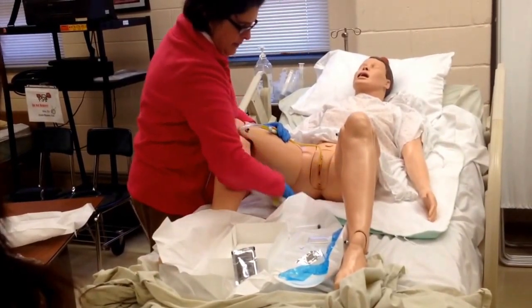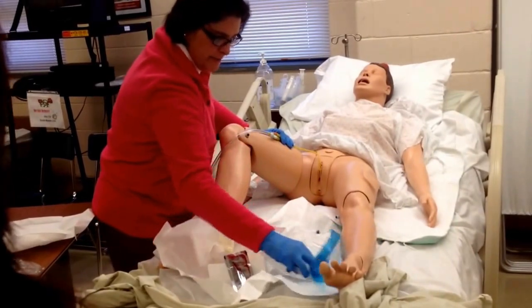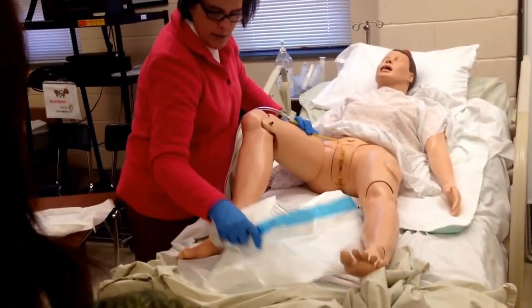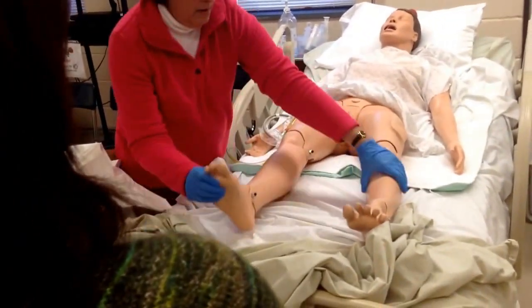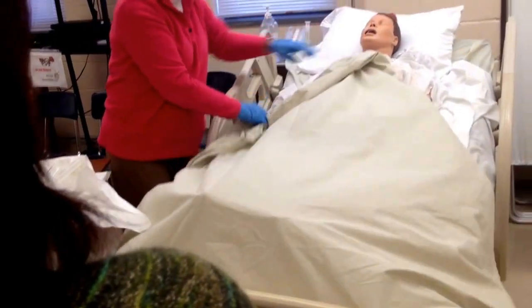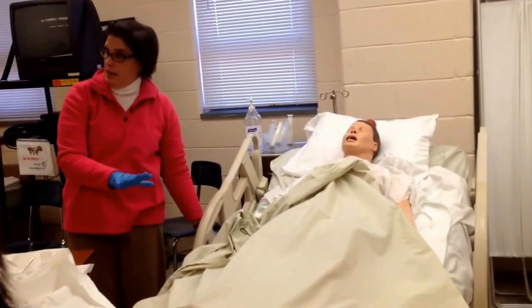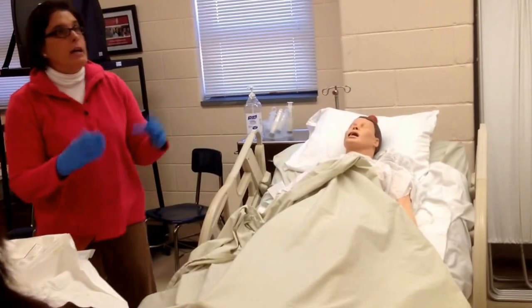You've finished cleaning them up. Put them back in a comfortable position. Okay, and then just ask them if they need anything, if they feel uncomfortable, or is everything okay? Then you're going to go and throw your kit away and document.